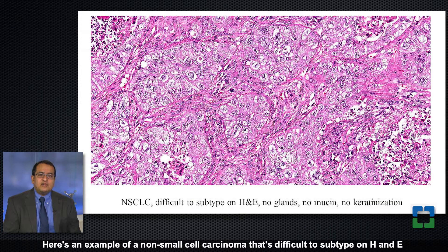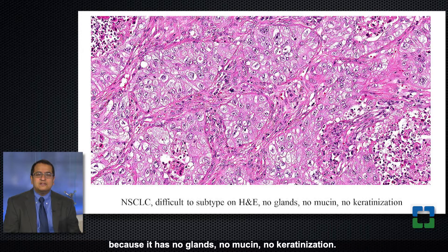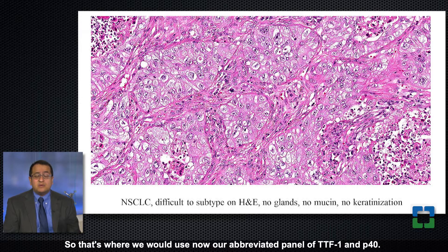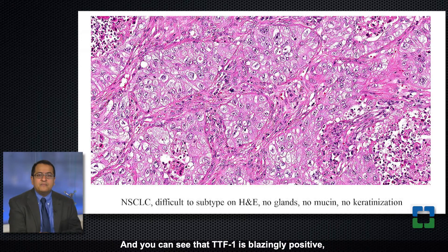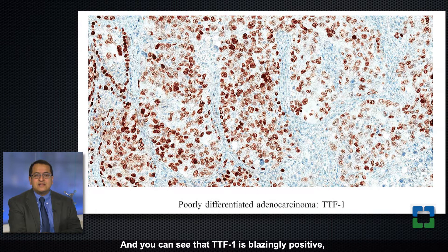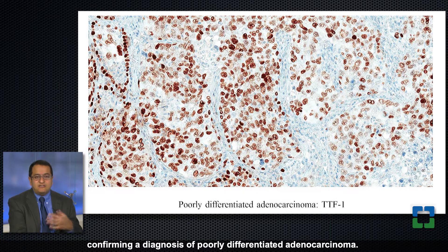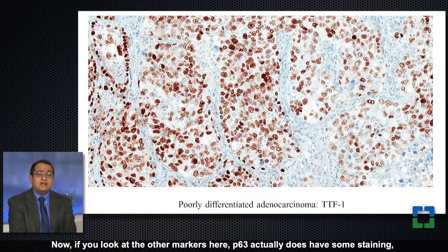Here's an example of a non-small cell carcinoma that's difficult to subtype on H&E because it has no glands, no mucin, no keratinization. That's where we would use our abbreviated panel of TTF1 and p40, and you can see that TTF1 is blazingly positive, confirming a diagnosis of poorly differentiated adenocarcinoma.